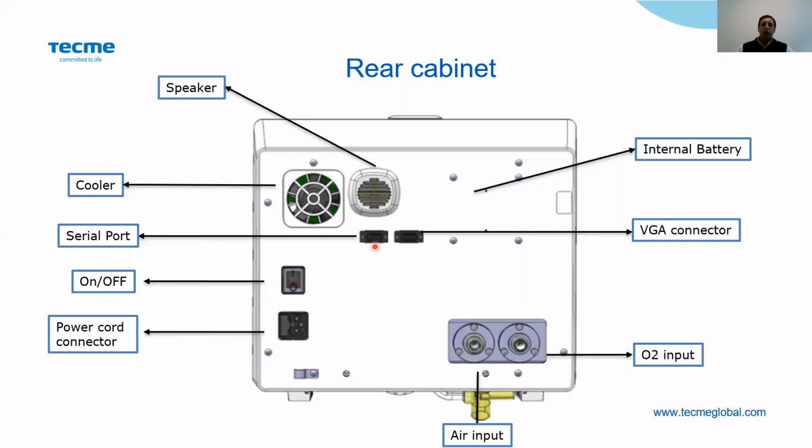Nowadays, we are dealing with two types of protocols. One is the Tecme protocol, and the other one is HL7. In the last software version that we have launched, we have added this HL7, which is a standard protocol, in order to be able to connect to the HIS.